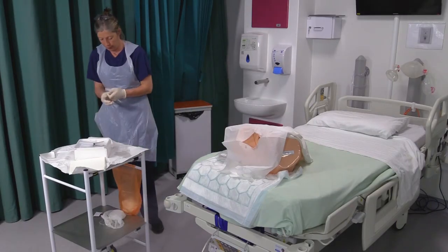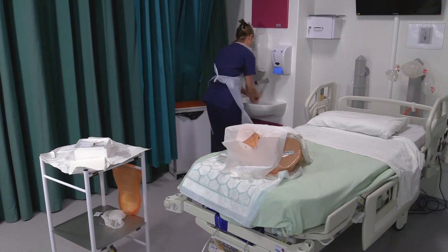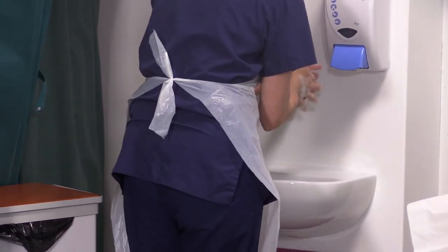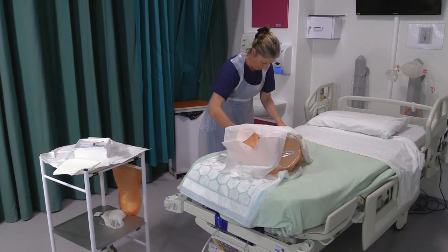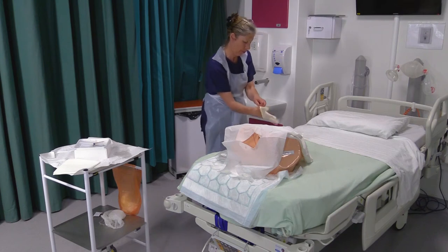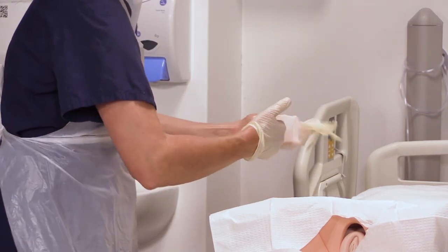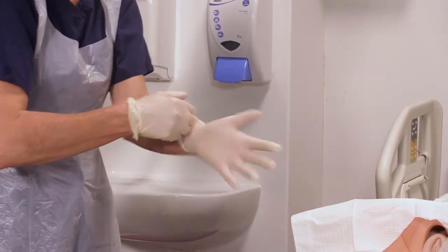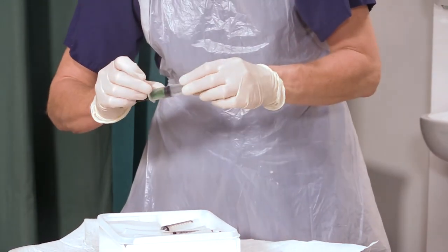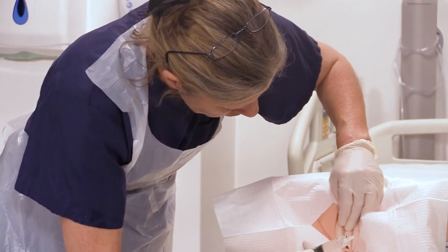Dispose of your gloves, wash and dry your hands, and put on a new sterile pair of gloves. Now take your lubricating gel and gently insert the nozzle of the gel into the urethral meatus.